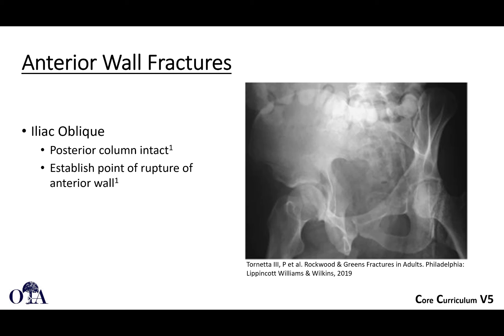On the iliac oblique, you can see the head makes it difficult to really recognize the fracture, but what you're really confirming here is that the posterior column is intact.